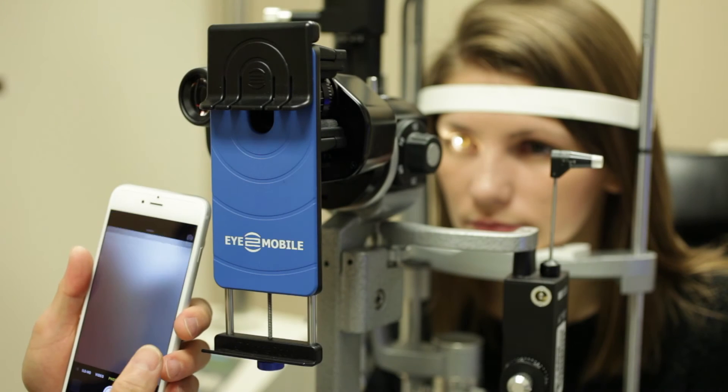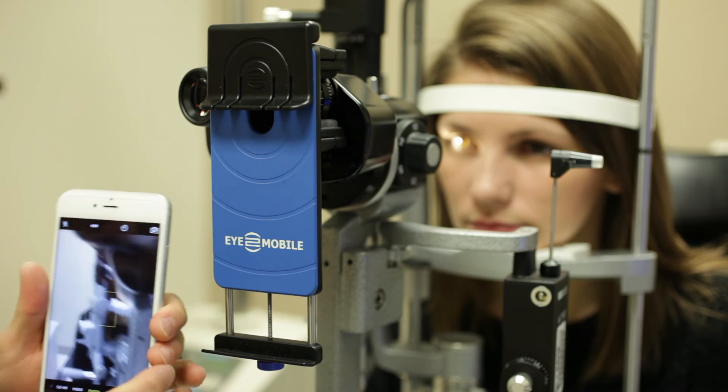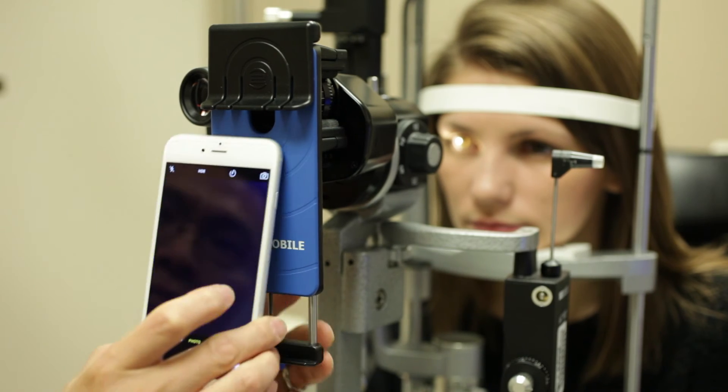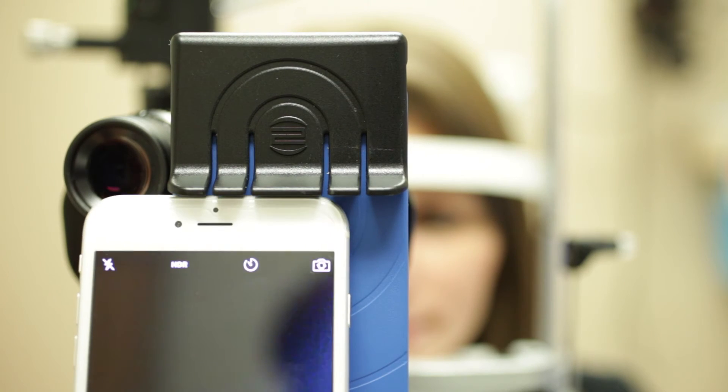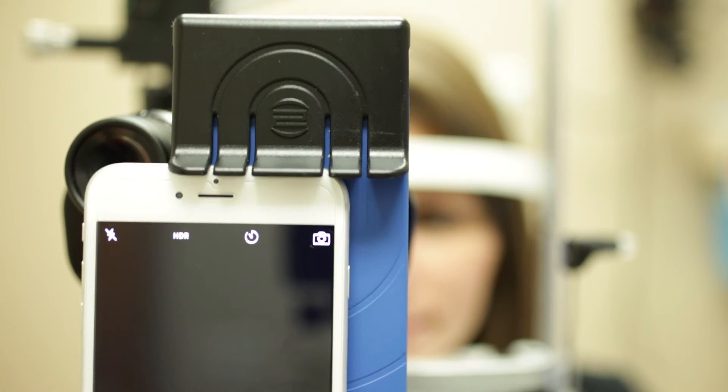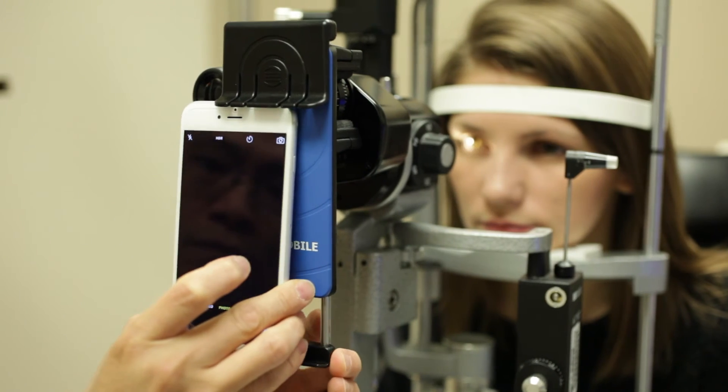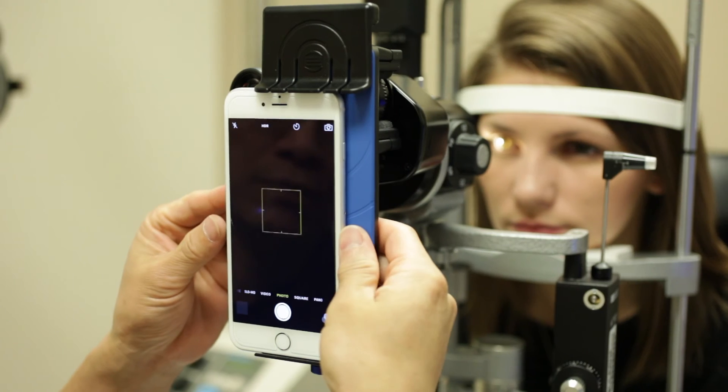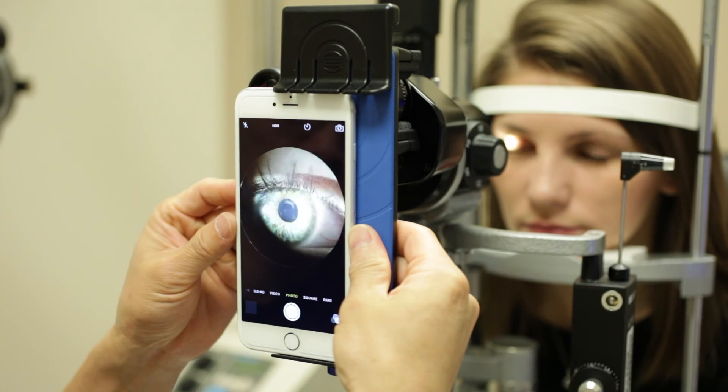Activate the camera on your phone. Aim the camera into the center of the eyepiece. Lift the phone clip and dock the phone.